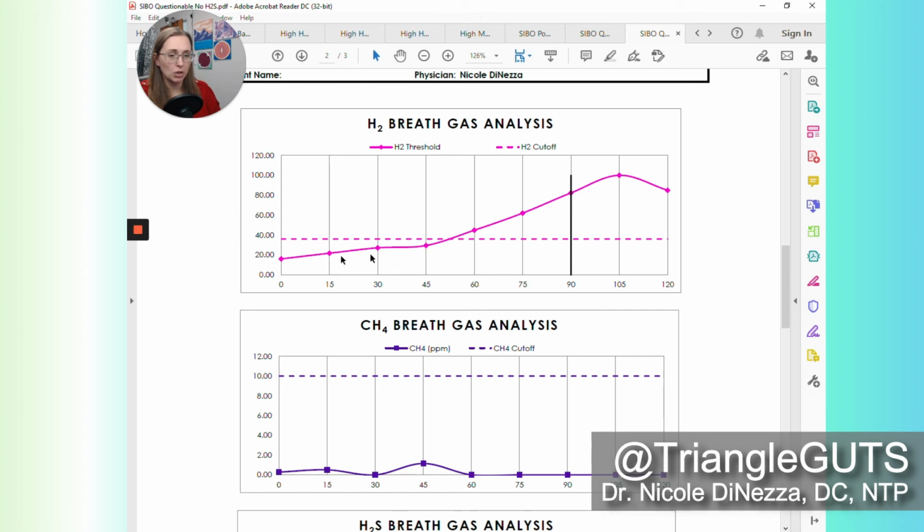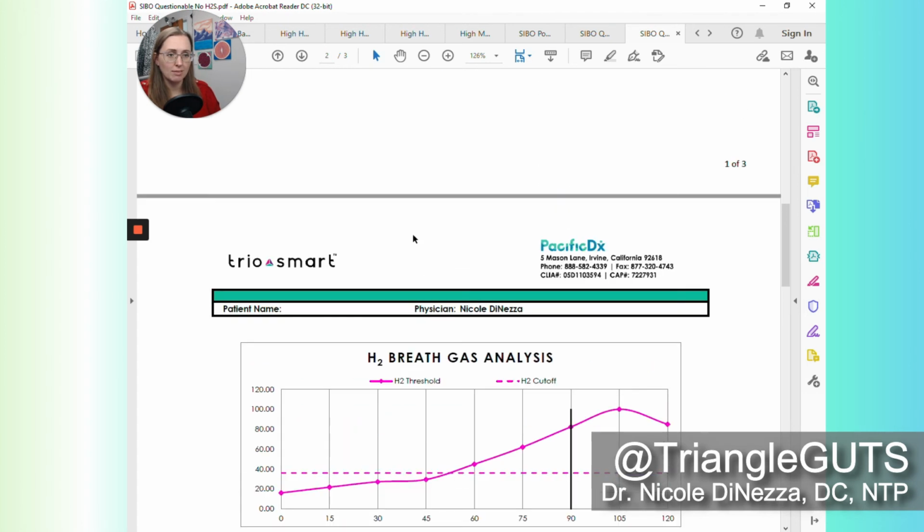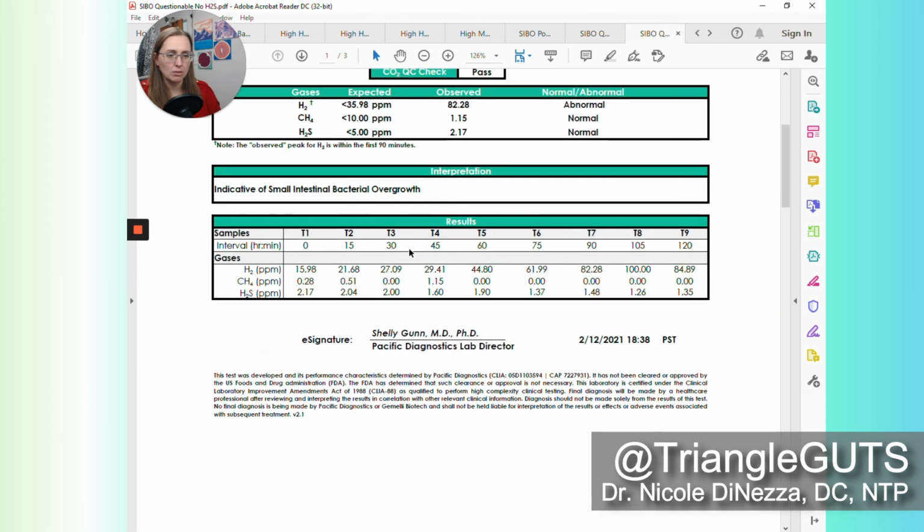So let's also look at the difference between 0 and 45. Does that reach the criteria? So we go from, again, basically 16 up to about 30. So it's right on the cusp. It would be right around 14 or 15 parts per million difference.